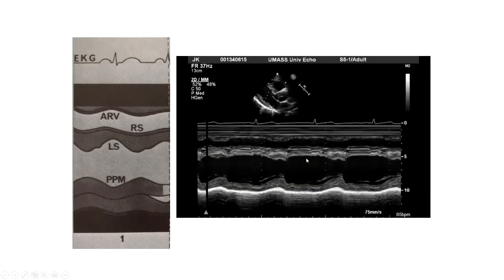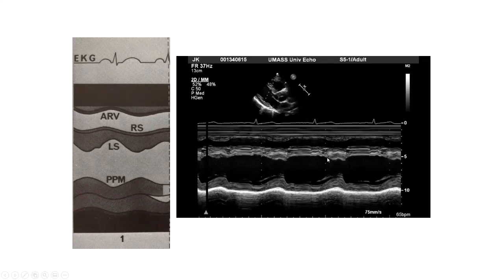We are encouraged by the guidelines to make our measurements using two-dimensional on-screen measurements. But until the 2005 guidelines recommendation, many labs were still using wall thicknesses measured either on 2D-directed M-mode or on the M-mode itself. A normal motion-mode echocardiogram through the left ventricular cavity shows the left ventricular cavity getting smaller in systole and reaching its largest dimension in diastole — after atrial systole when left ventricular filling is at its maximum.